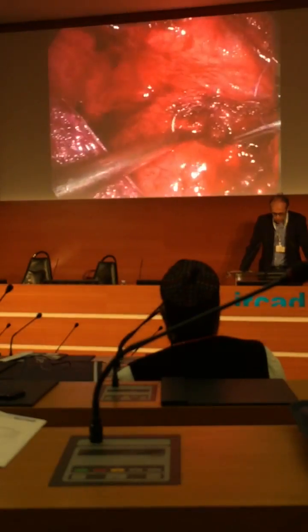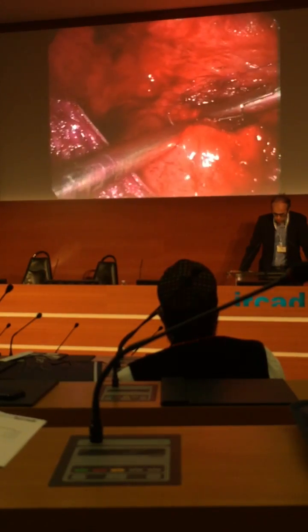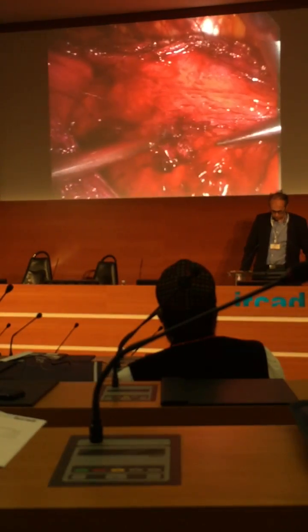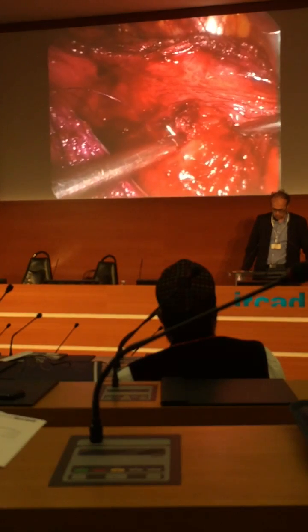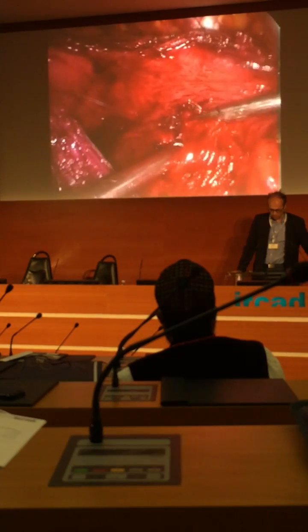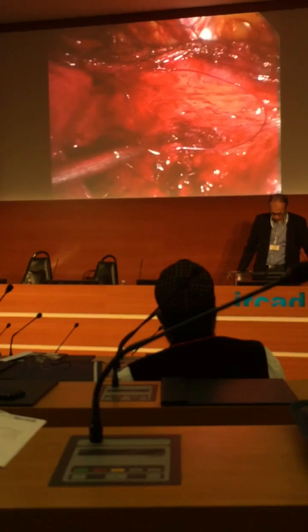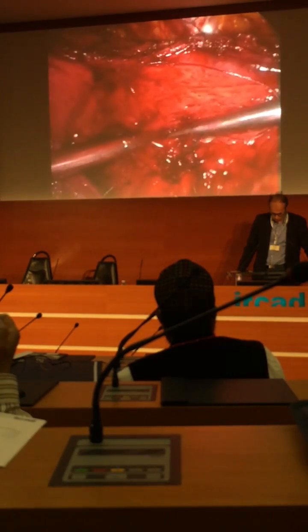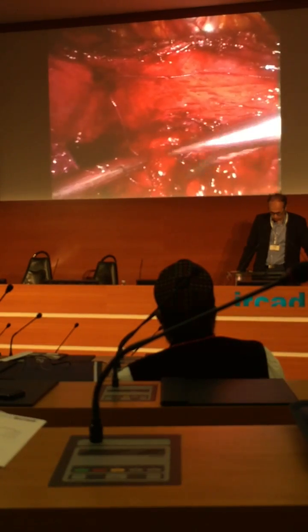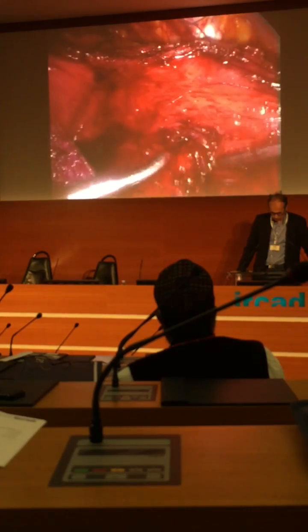The next step will be to close the neck of the diverticula with a suture that takes the entire wall of the bladder, not only the mucosa, but also the muscle, because as you know, the diverticula is a kind of hernia of the muscle part of the bladder. So you can use a running suture, you can use X points, interrupted suture, depending on the width of the opening.